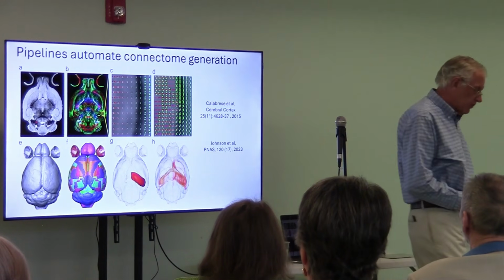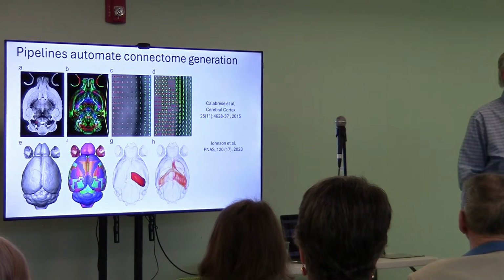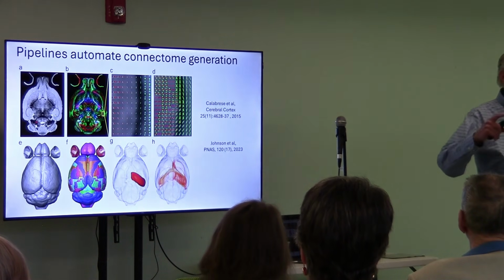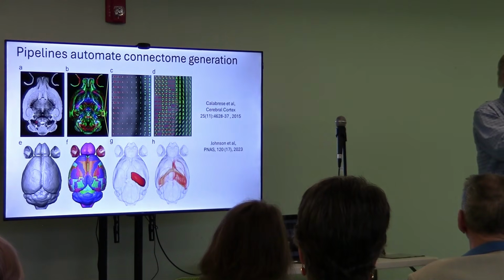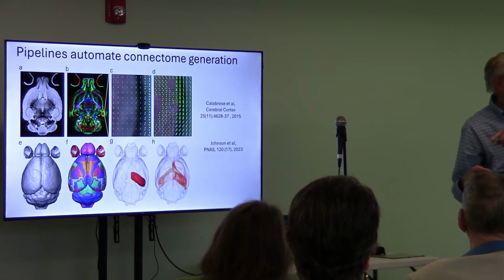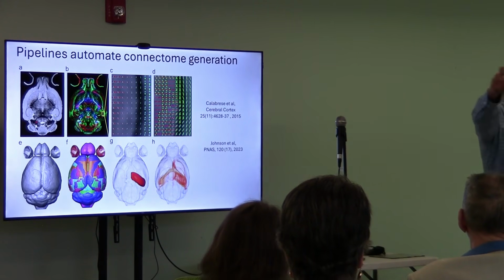But there was some more work. The problem is, the Lord has not made it simple. You think that there's one set of tracks going through every voxel. There aren't. So there would be some coming from this direction, some coming from this direction. How do you distinguish those? If you're tracking in this direction and you get into a voxel and there's one going off in this direction, you keep track of that.